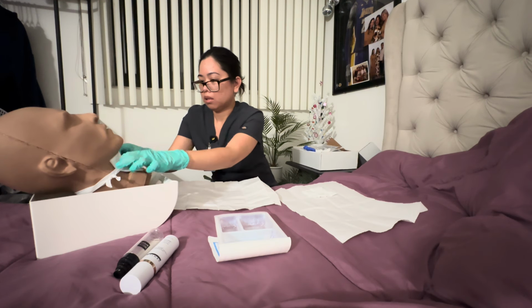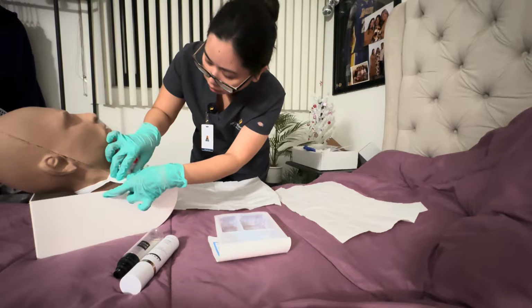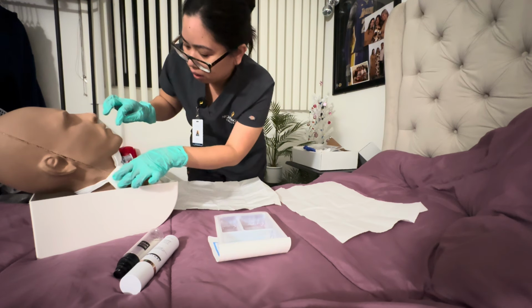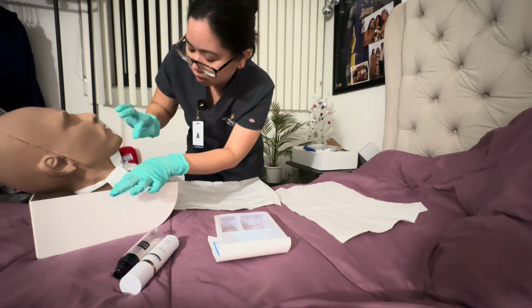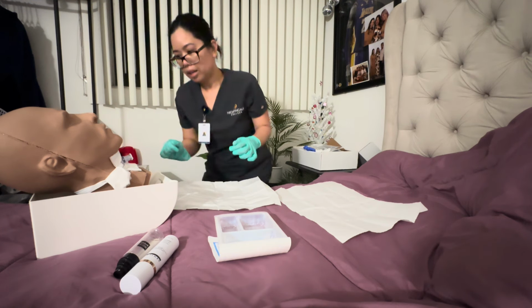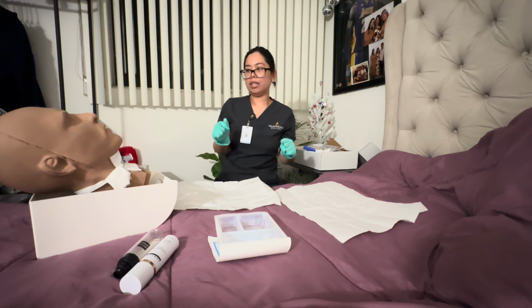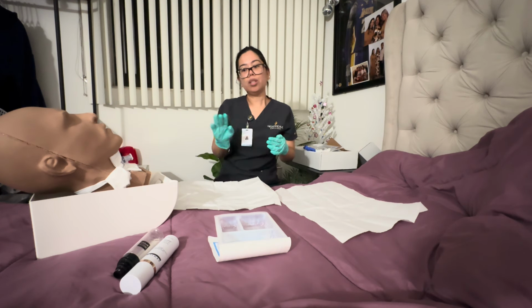And we're just gonna put a tape on that gauze, not on the skin. Okay, and once you're done with that, you can go ahead and let the patient know that you're done.